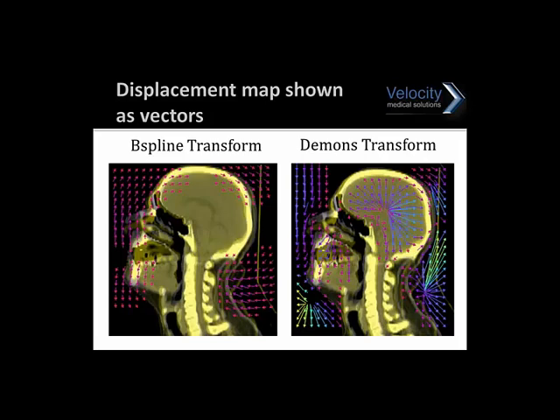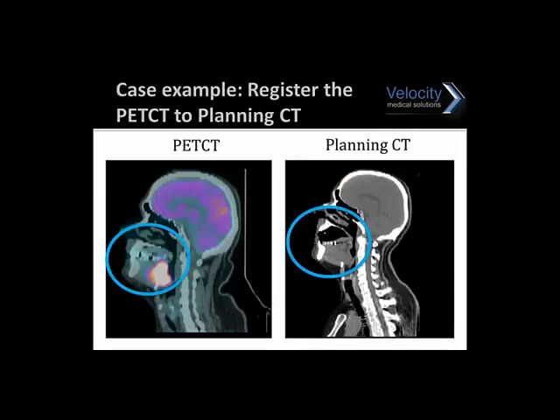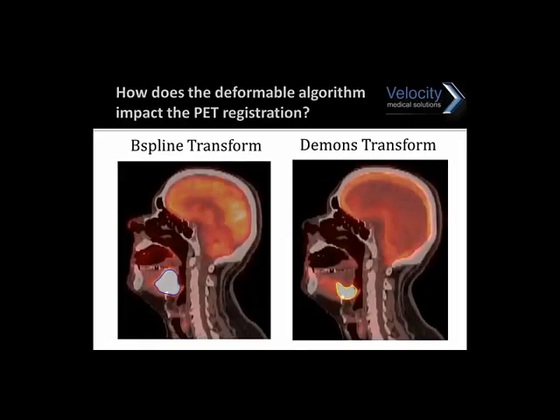Okay, question 4. Is deformable registration safe to use? A, yes, there is recent scientific research that validates deformable for all scenarios. B, yes, but only in certain areas of the body. C, use your clinical judgment as to when deformable registration is applicable. So I'll launch now and give another 10 seconds to vote. Okay, cool. And 91% answer C, which is the right answer.